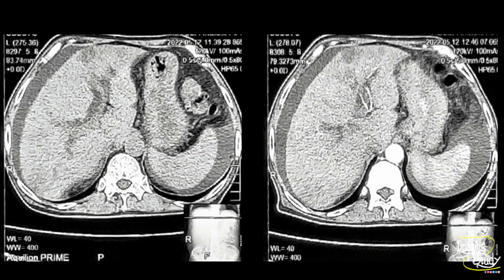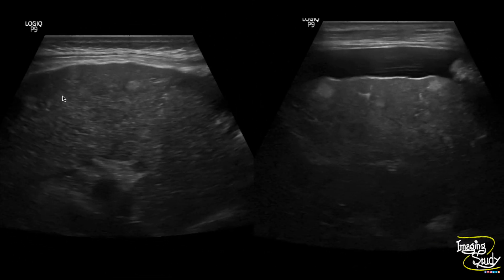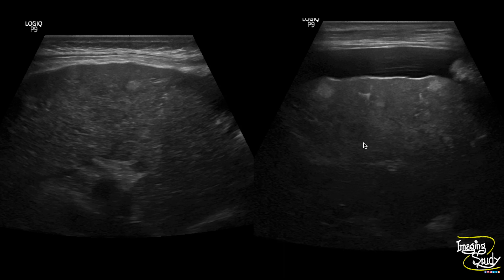We have done a CT scan in this patient. Here you can see the lesion at the left lobe that we showed earlier. With the linear transducer view, the irregularity is quite well visualized with the heterogeneous nodular appearance of the parenchyma. These hypo- and hyperechoic nodular lesions may be metastatic deposits or cirrhotic nodules — a triphasic CT scan may help differentiate better.